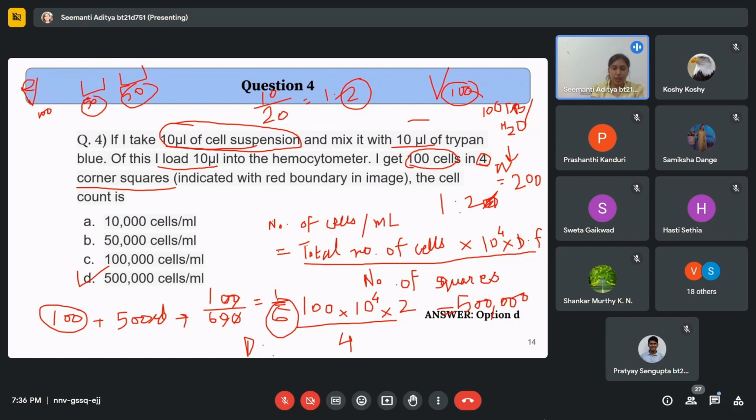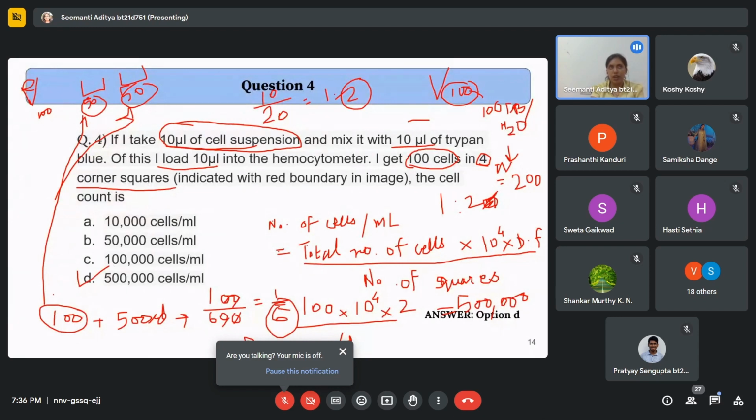When we split the cells, suppose the same 100 microliter of cells is split into 50 microliter and 50 microliter, that means there is equal splitting. If in 100 microliter of cells there were about 5 lakh cells, then we put 2 lakh 50,000 cells in each.